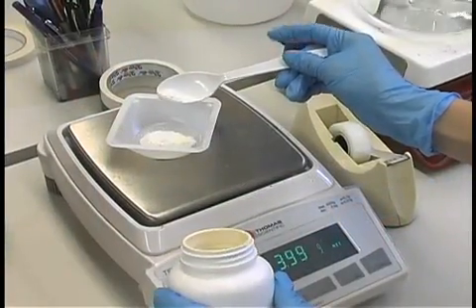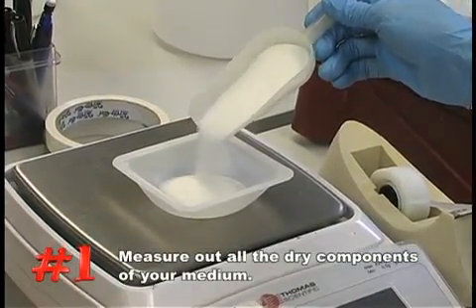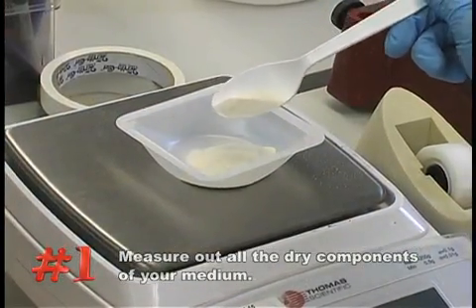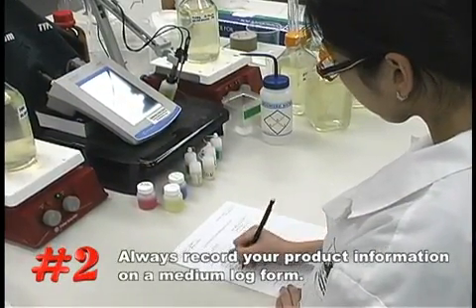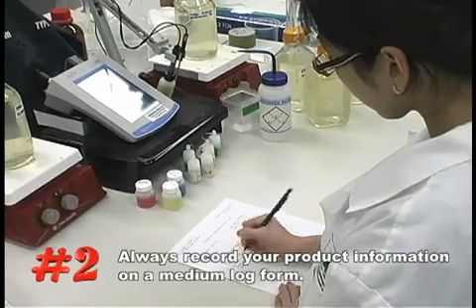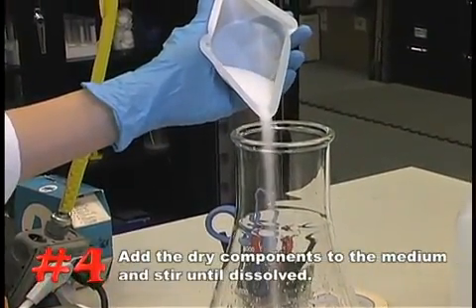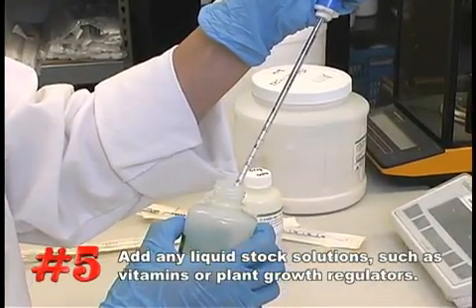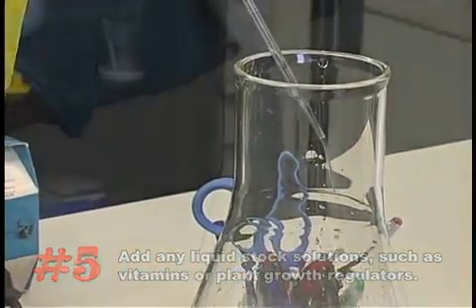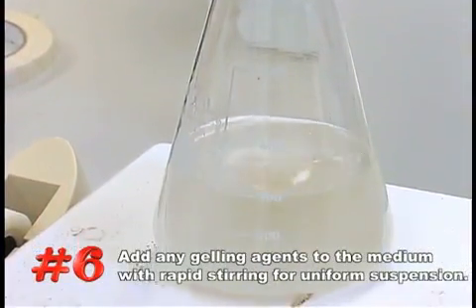To recap: number one, measure out all the dry components required — using a pre-formulated dry powder medium will reduce the number of components to be weighed and reduce the possibility of error. Number two, always record your product number, lot numbers, and weights on a medium log form. Number three, measure out 80% of the final volume of water to be used. Number four, add the dry components to the medium and stir until dissolved. Number five, add any liquid stock solutions such as vitamins or plant growth regulators. Number six, slowly add the gelling agent with rapid stirring to obtain a uniform suspension.